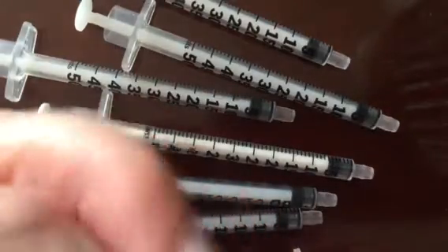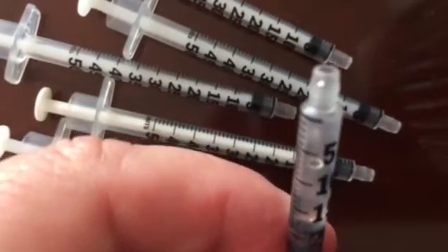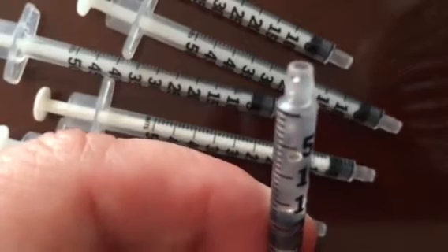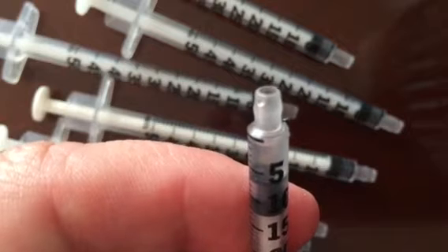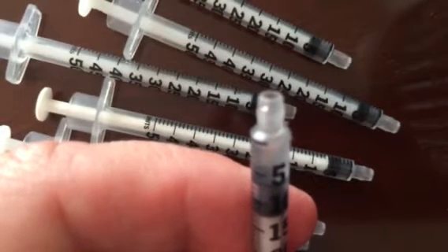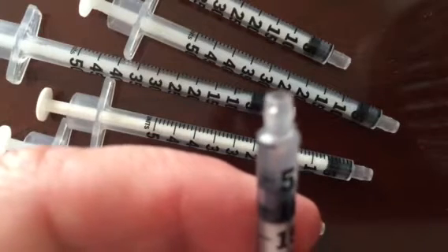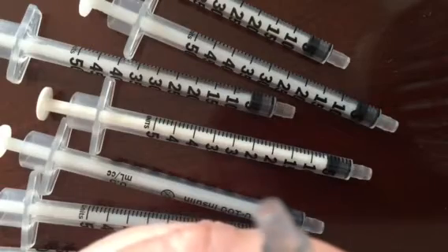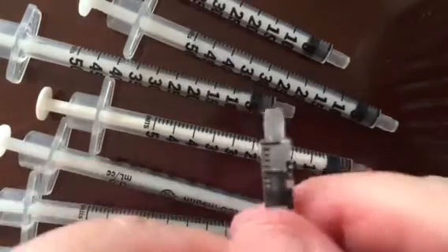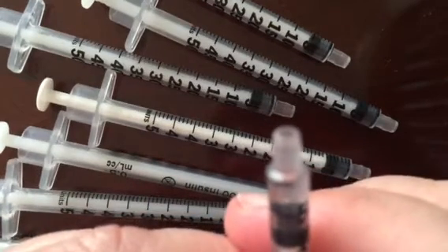Of course, you don't tap it if you're drawing up on your syringe. NatPara is a very unstable drug, so don't tap the pen, the insulin needle, like I just did. Let me push all the air out. Try not to push too much. All right, so one daily dose right here.